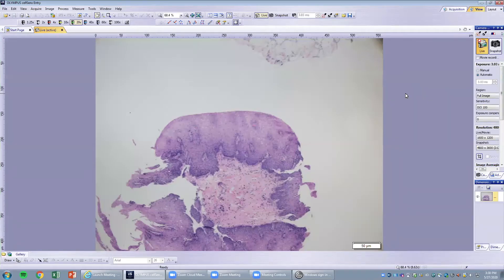I'm Marian Peju. I'm going to talk about actual slides and show you a biopsy of the esophagus. This esophageal biopsy, as you can see, is lined by squamous epithelium. You have basal cells at the base and it's maturing to the surface.